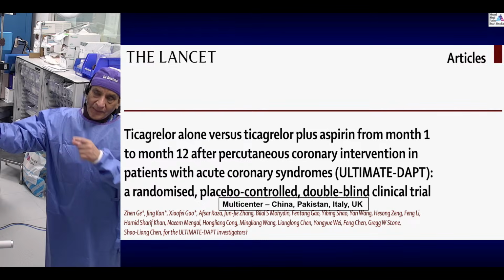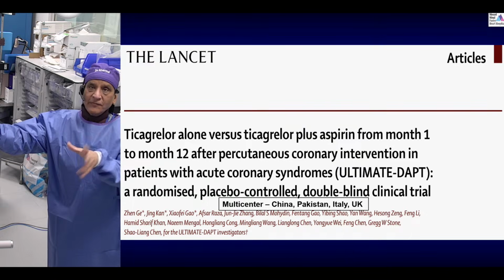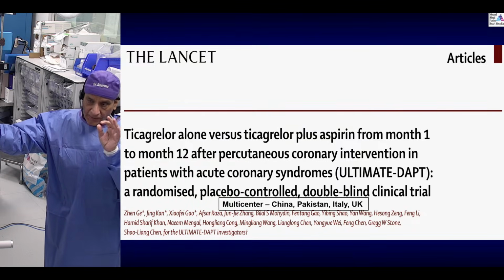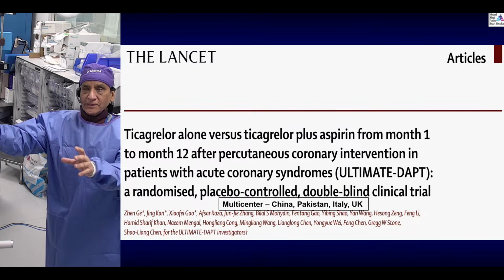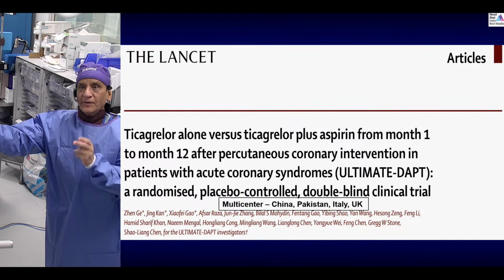So coming back to the point that Anu mentioned, that vascular complication is so important. In these patients, the key is, right now we have 60 patients enrolled in our Protect 4 trial, and we have 0 vascular complications. It requires extra effort, I would say maintenance of the vascular access by the procedural planning, and then where to puncture, what to puncture, and then up and over, and then post, whether to use 2 pre-close, or 1 pre-close with 1 Angio-Seal, but that's very, very important.